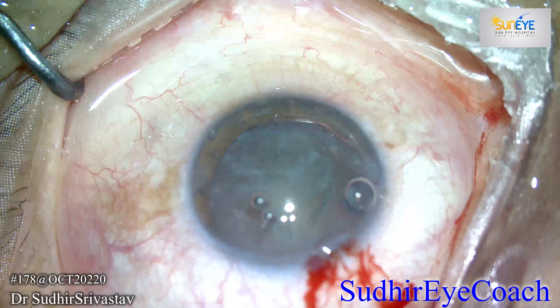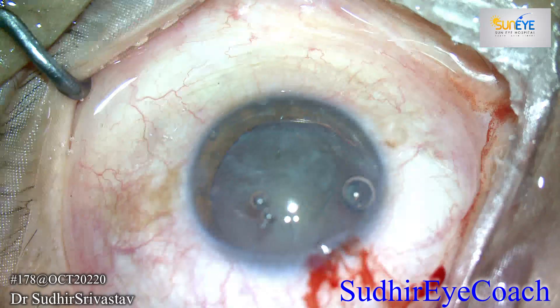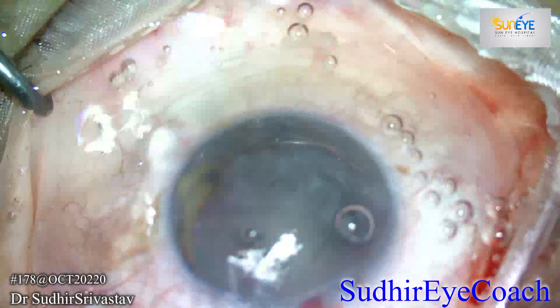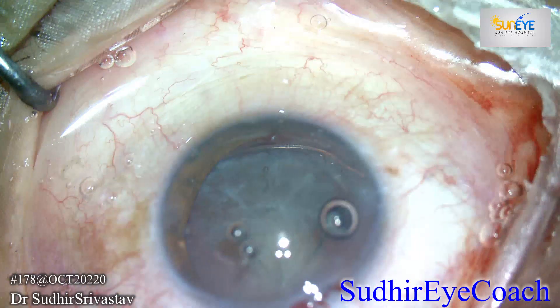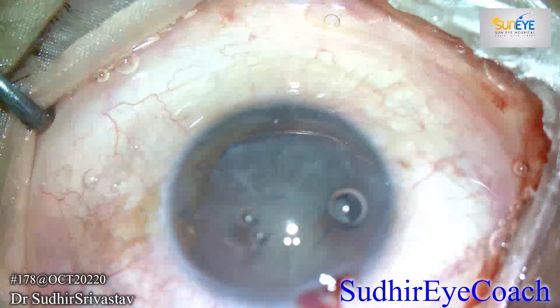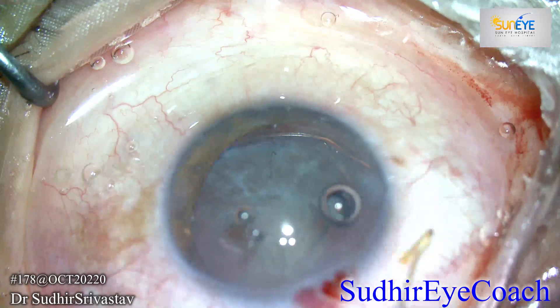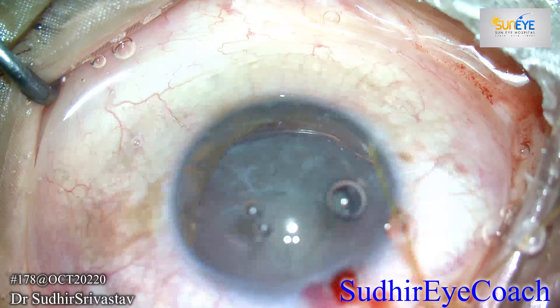Before starting phacoemulsification, I thought to give more strength to the capsule by placing capsular hooks in the areas where the capsule is hanging, because I wanted to be 100% sure that during FACO I should not create stretch on the capsule.